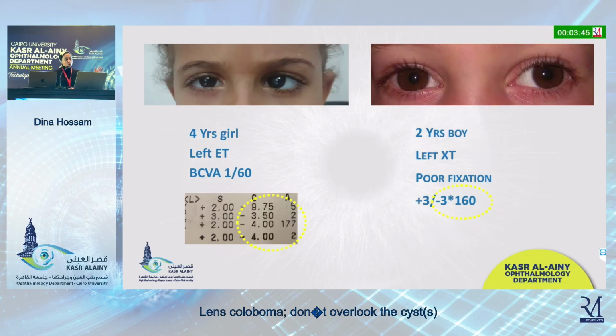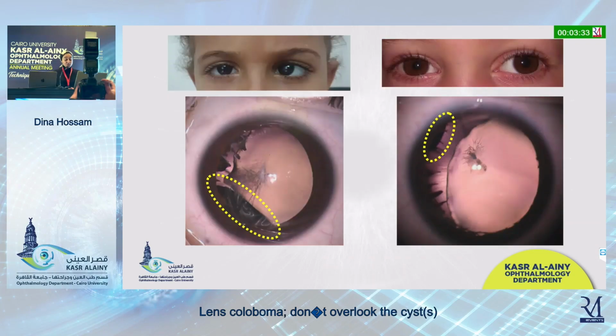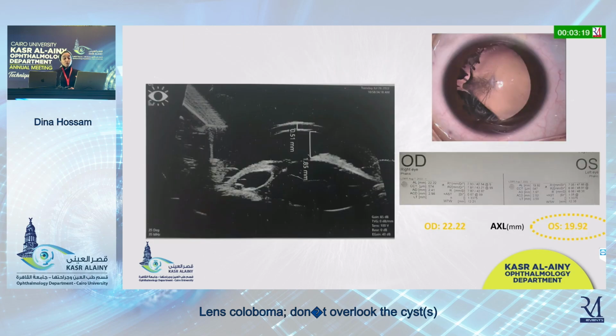طيب I'll be presenting two surgical videos. Two cases presented more or less very similar presentation, both with sensory strabismus, very deep amblyopia, very high lenticular astigmatism, and this was actually the anterior segment photography of both cases with lens coloboma, persistent fetal vasculature, thick elongated ciliary body processes, and a large infranasal ciliary body cyst for the girl, an upper nasal cyst for the boy.